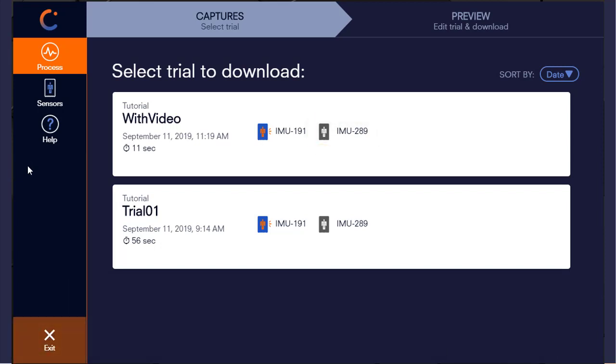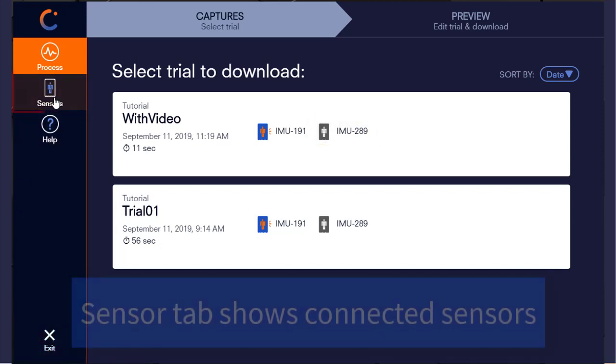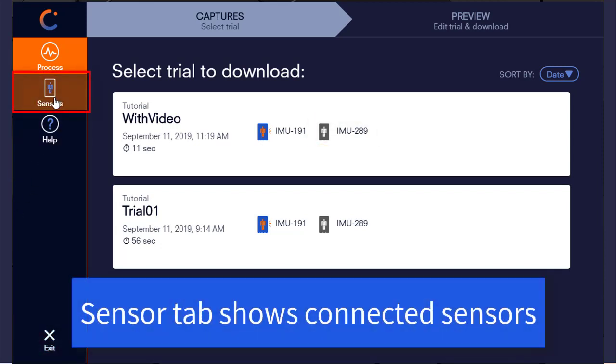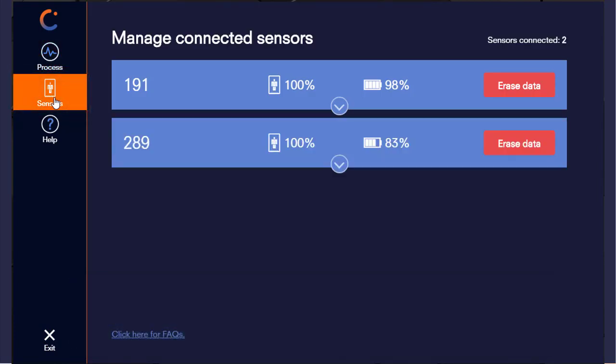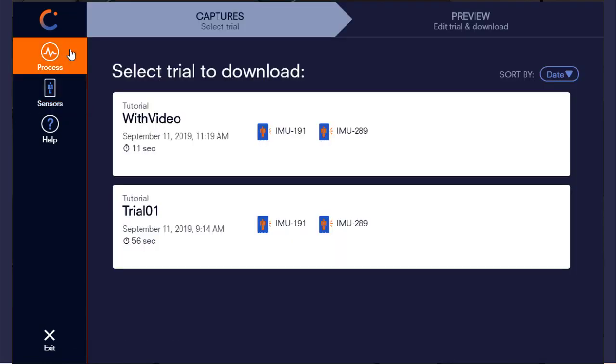We can also verify this quickly by looking at the Sensors tab. Plugging in the second sensor will now update this list, and navigating back to the trials list will reflect this.